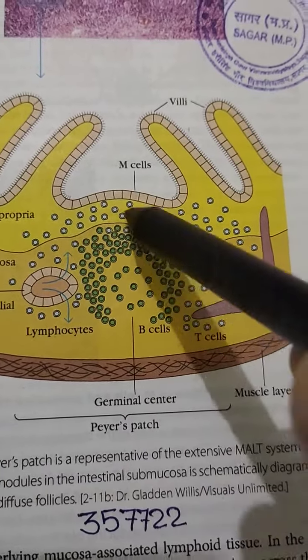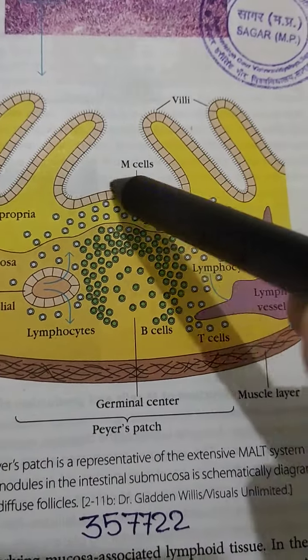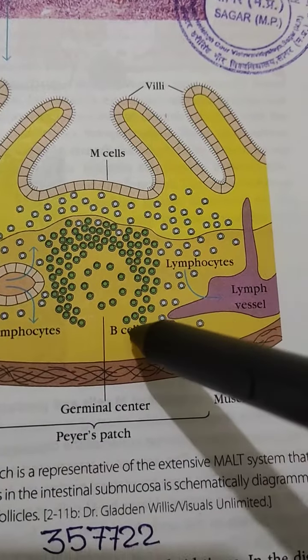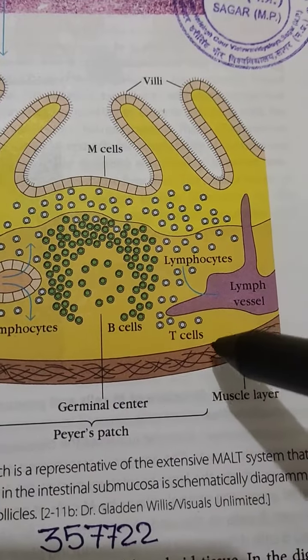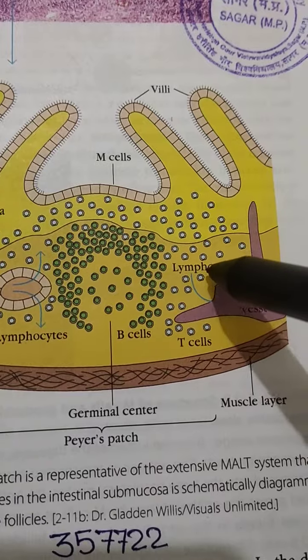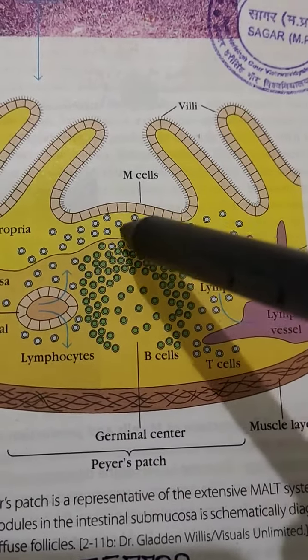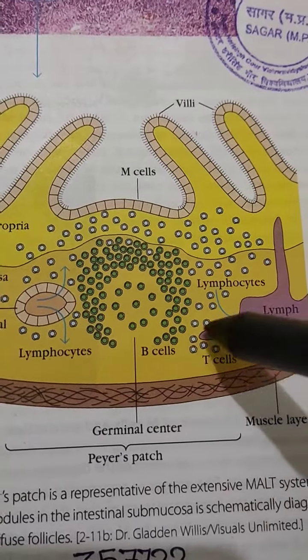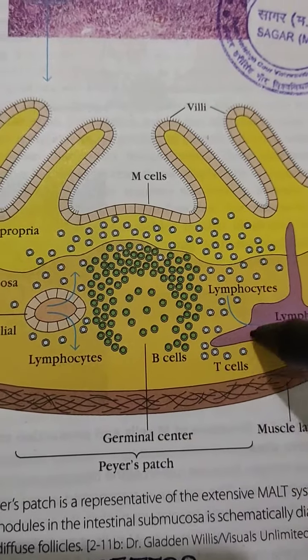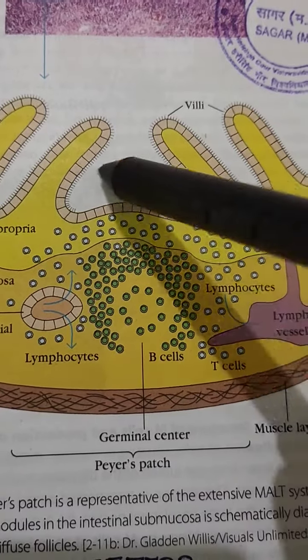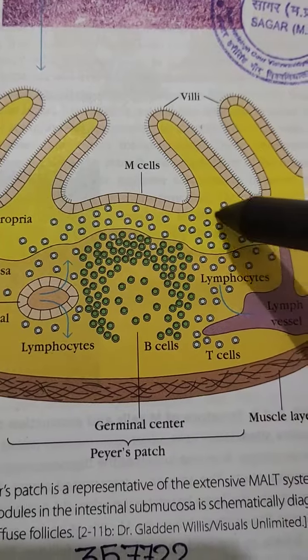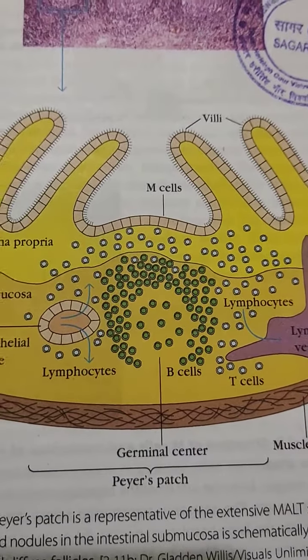These are germinal centers in the intestinal submucosa, and these are B cells and T cells in the germinal center, and these are lymphocytes. So lymphocytes — B cells and T cells together — form the immune cells or immune function organs.